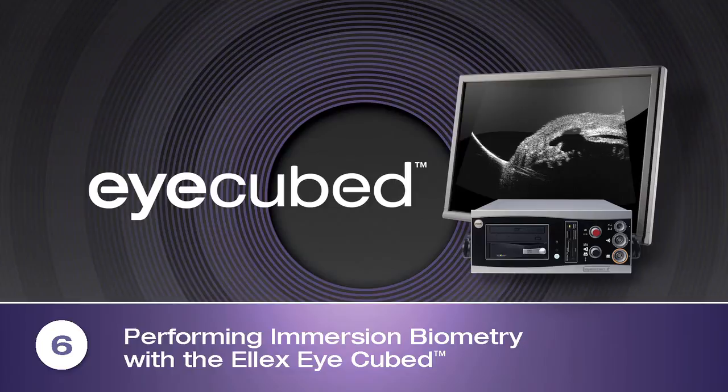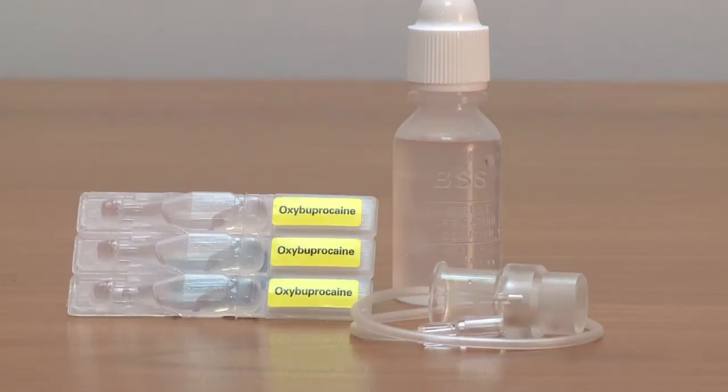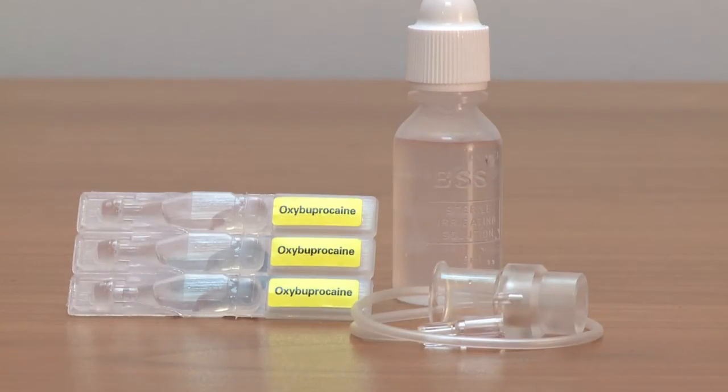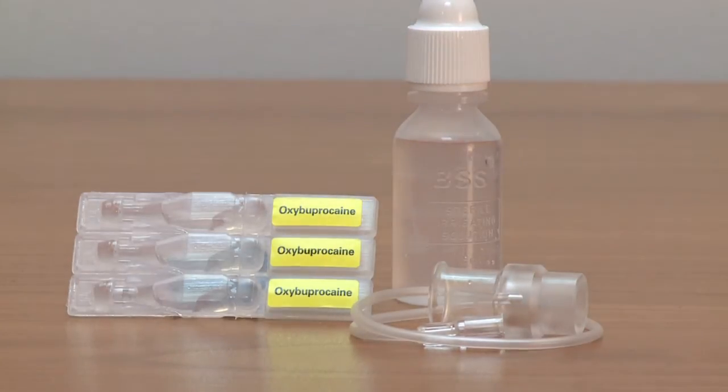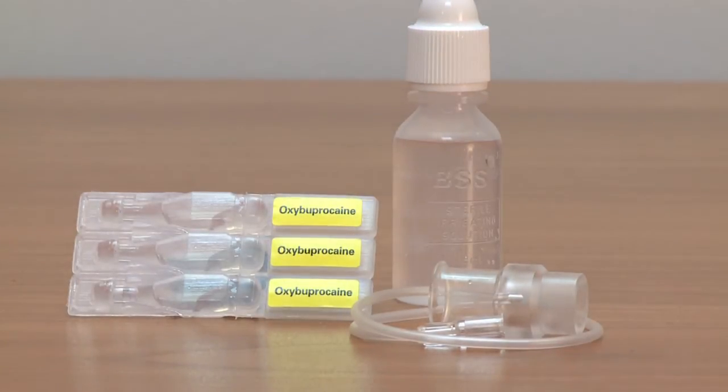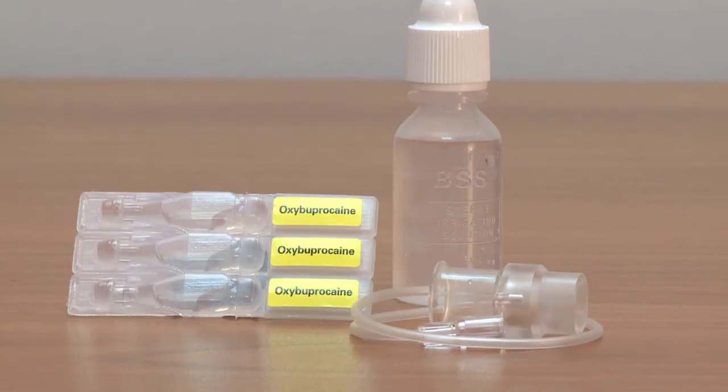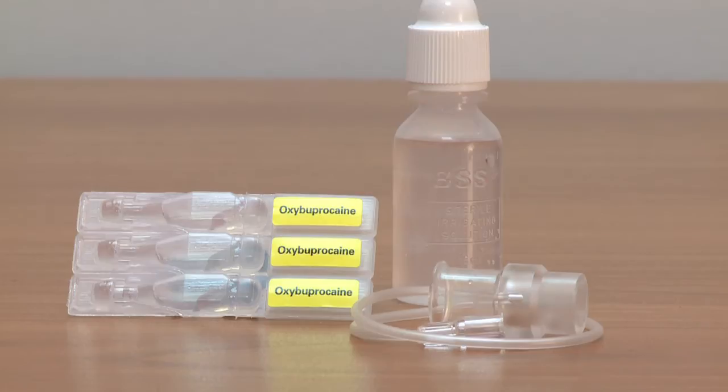The first step is to assemble the immersion biometry kit, which will contain the following: topical anesthetic, the specially designed cone immersion shell supplied with the iCubed, a screw top bottle of balanced salt solution or BSS, and tissues to catch the BSS at the end of the examination.